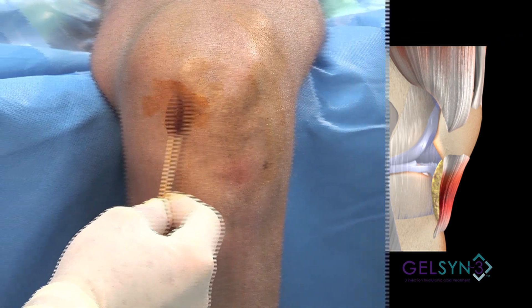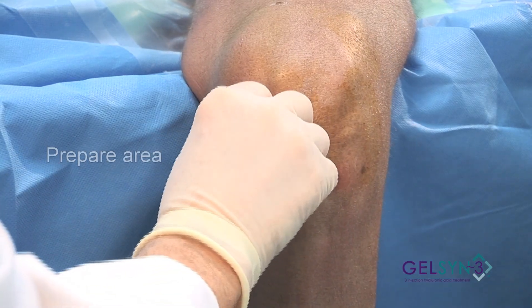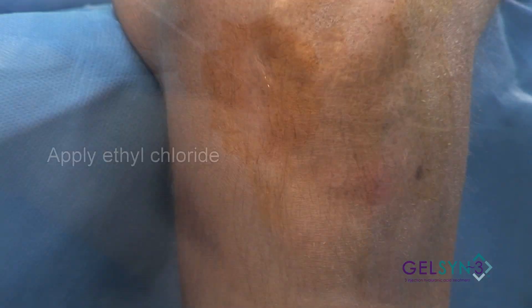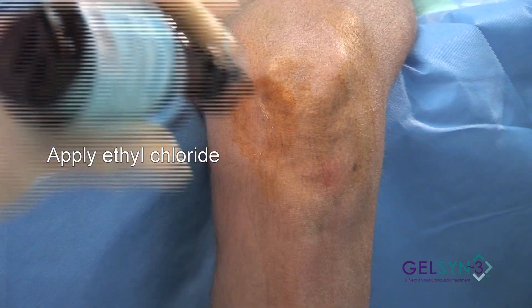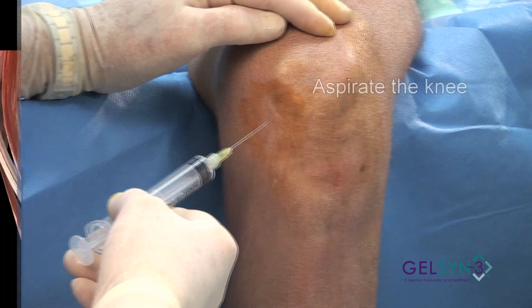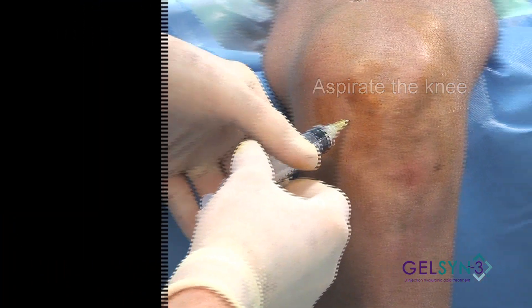We'll paint and spray. Insert the needle, aiming for the intercondylar notch.